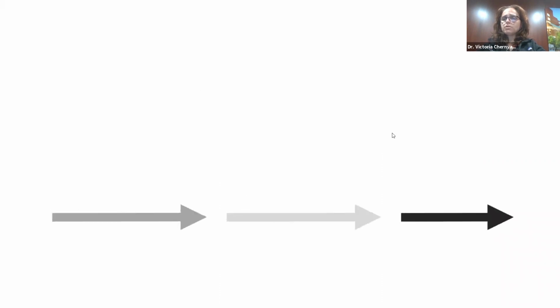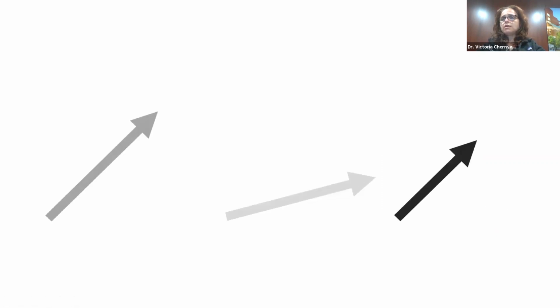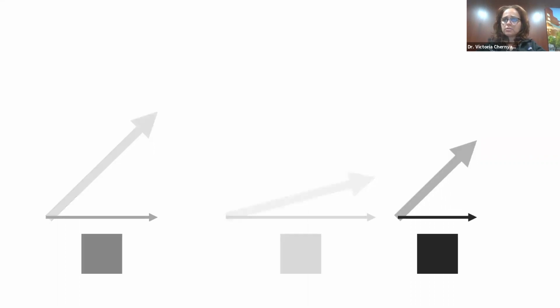We give out an RF pulse, and then these two tissues relax at the same rate, but this one is a little bit different. So at the time when we listen, you can see that we will catch each of these vectors at a different position, and the magnitude of the transverse vector is going to be different. And again, this magnitude will determine how bright the pixel is. So a little voxel that gives you this much signal would be this gray, more signal brighter, less signal darker. And that's in essence how we create the image.